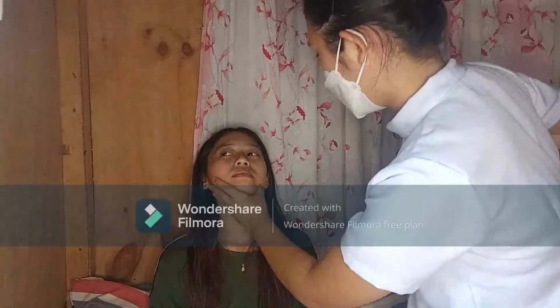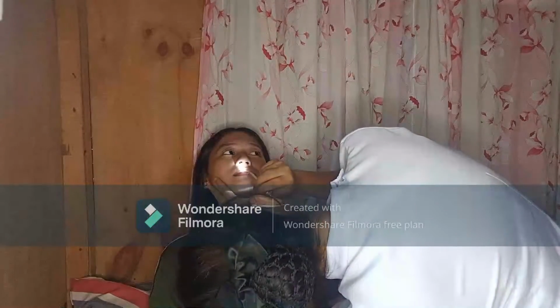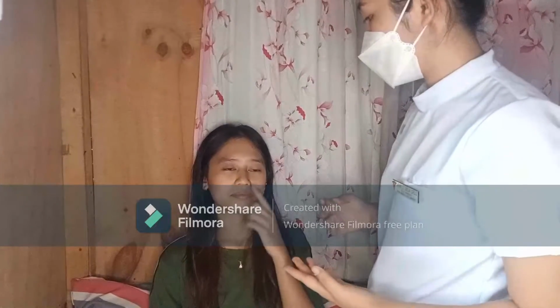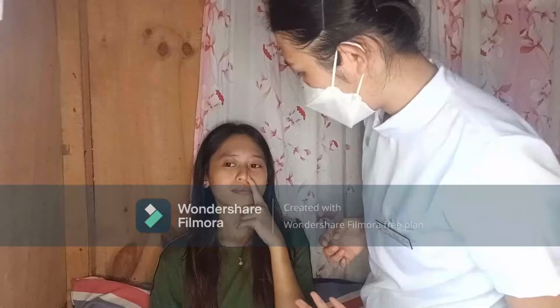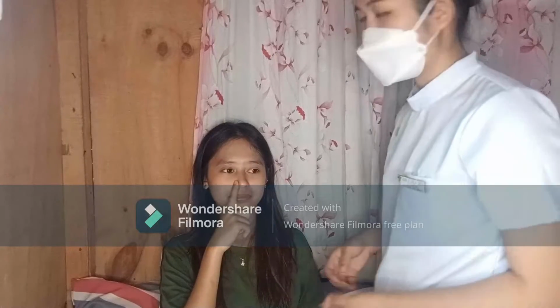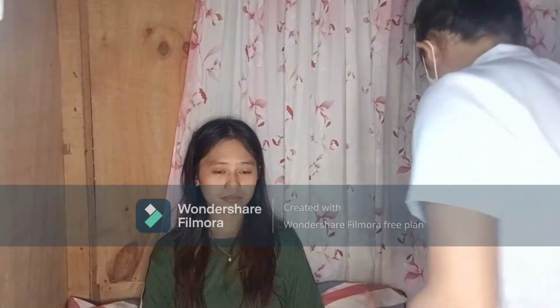Next, assess patency of nares by having the patient occlude each nostril and breathe, and repeat for the other nostril. Okay, ma'am, can you breathe using one nostril while occluding the other? Determine presence of gag reflex by touching the sides of the oropharynx. Thank you, ma'am. Now we will assess your gag reflex.